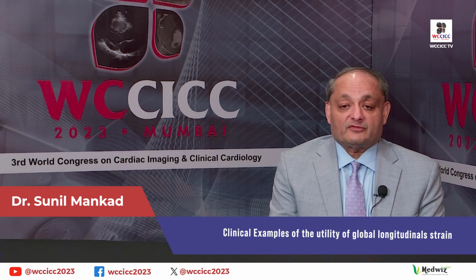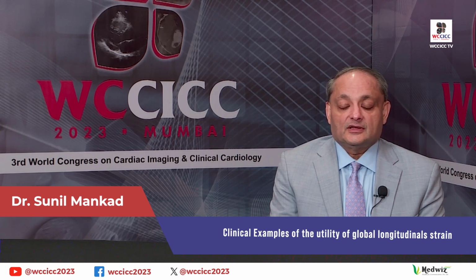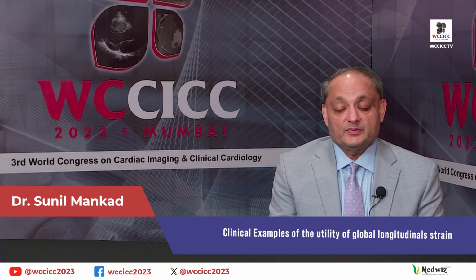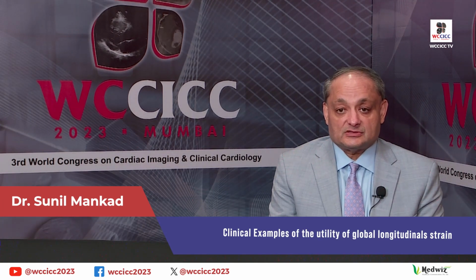A drop of about 15% in strain values is definitely going to be clinically significant. And because strain is more reproducible and more accurate than ejection fraction, it really is important to look at this and continue to accumulate data in the setting of chemotherapy-related cardiac dysfunction.